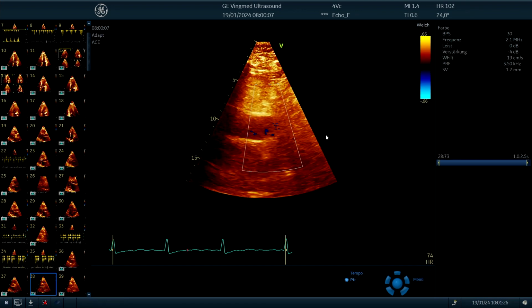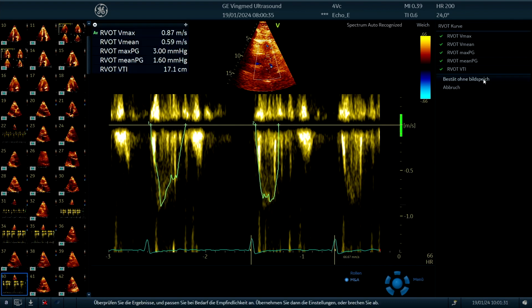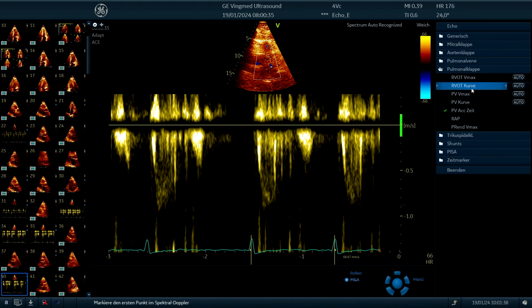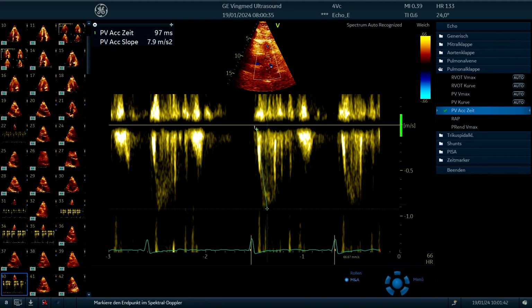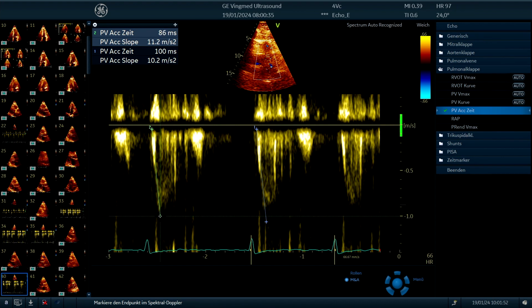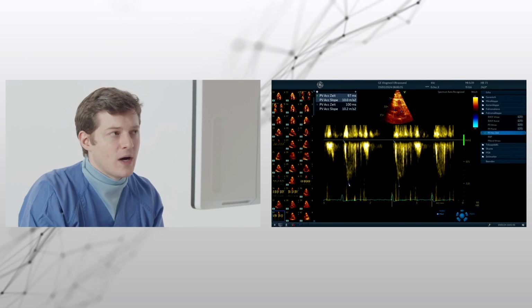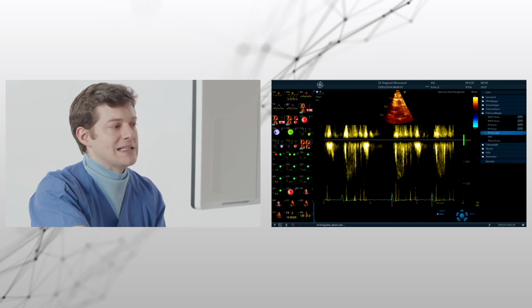So we move on to the short axis view of the pulmonary outflow tract. It measures the RVOT and the RVOT max and the gradients, but both measurements, they are not optimal, so I wouldn't use them. If the automatic measurements work, then they're really good to use. And here it's also harder to see the signal over here. I would not adjust the gain too much, because then it leads to overestimation, underestimation. But so we have several signals where we think it's always around 100, a little bit more milliseconds.